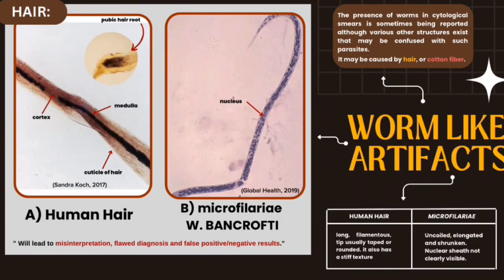As for worm-like artifacts, the presence of worms in cytological smears is sometimes reported, although various other structures exist that may be confused with parasites. Human hair, especially pubic hair, can mimic parasite microfilariae.